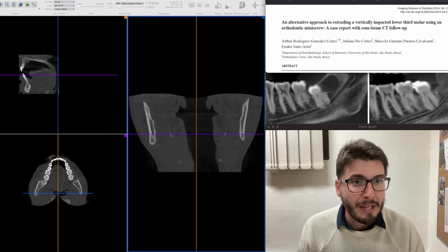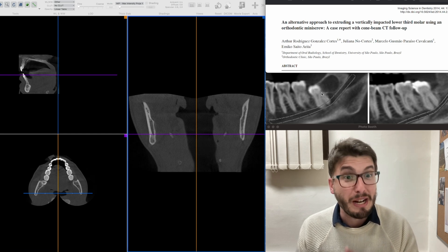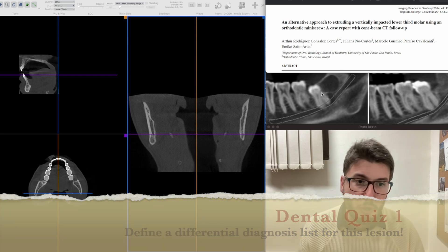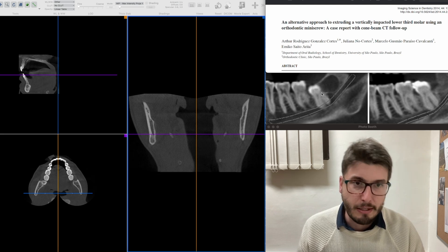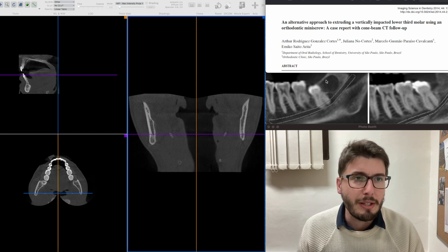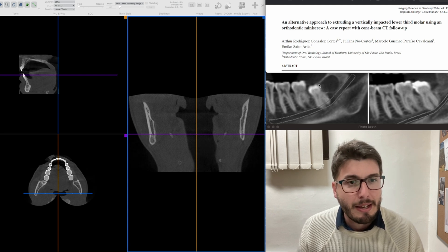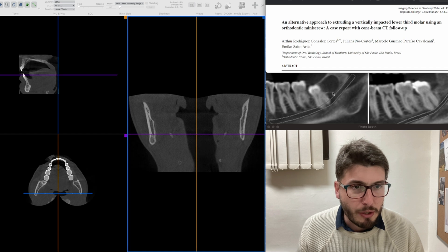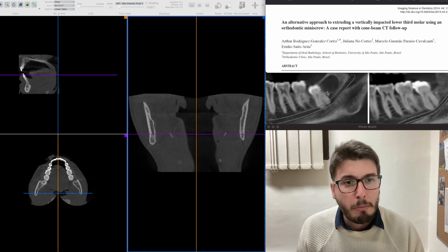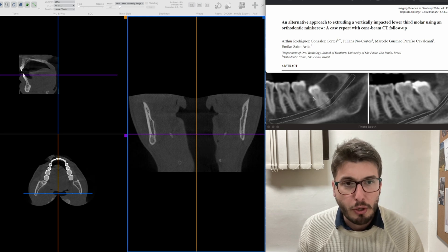Feel free to pause the video and try to diagnose this hypodense lesion yourself — at least the first option on your differential diagnosis list. This was confirmed by biopsy and histological analysis as a dentigerous cyst, in its lateral pattern. The lesion was causing slight expansion of the alveolar crest, and its inferior limit was very close to the mandibular canal, attached to the distal CEJ of the third molar.